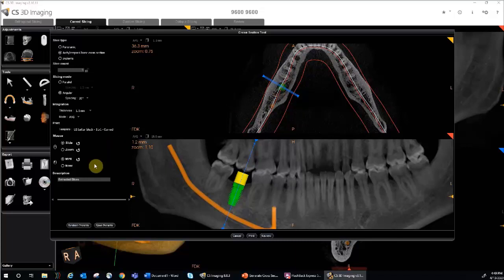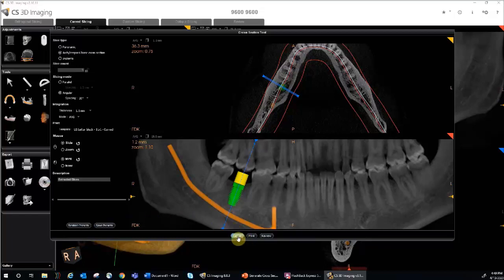Notice at the bottom, you can save the presets for future use on another cross-section report. In the center at the bottom, you can cancel the generate cross-section report, you can print which sends it to our CS Film Composer, or you can review it which will send it to the review tab. We're going to hit print.